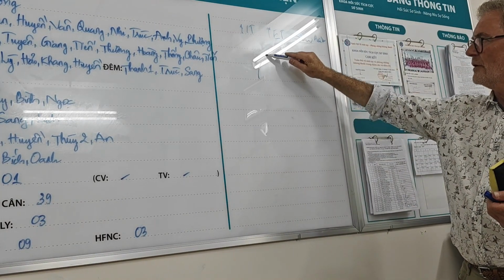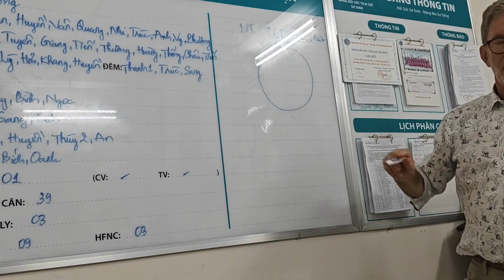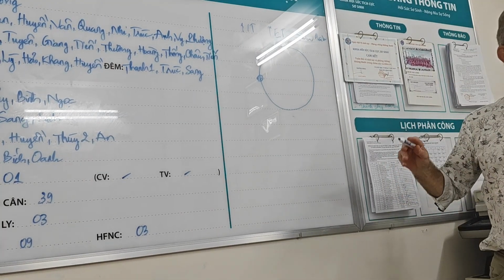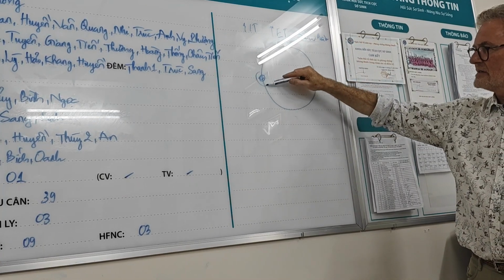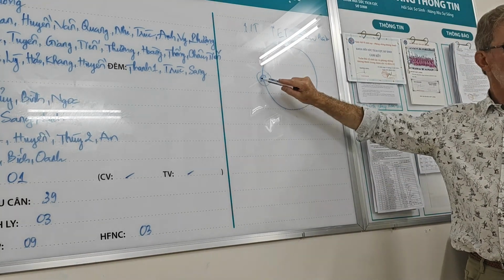And so volume flow loops kind of look like this, a big circle. The important part about the volume flow loop is if your lungs are behaving normally, this can be a bit wiggly and a bit strange shaped. But what you need to see is that at the end of exhalation, it's come back to the same point.